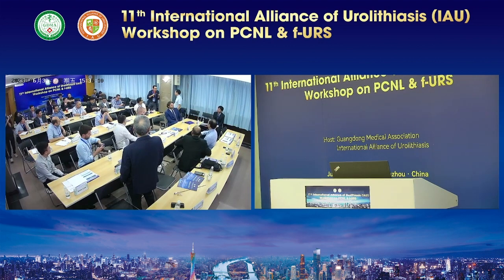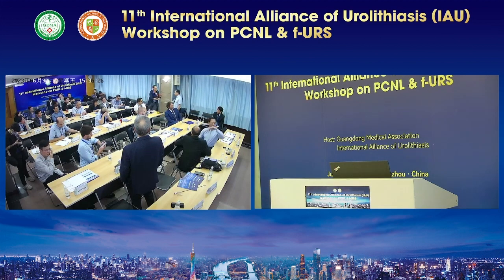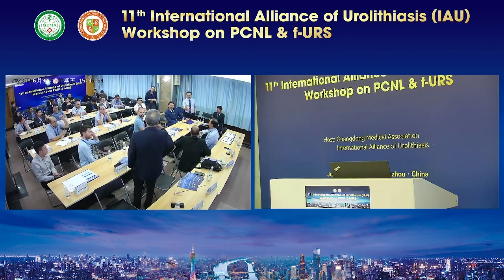We can do, for example, 2 punctures before dilatation. It's easier to do the second puncture before the dilatation for the first. Or step by step: perform one and eliminate the stone, and then perform another tract. Yes. But it's a little bit difficult to do the second. If you only use ultrasound guidance, it's difficult to perform another puncture. But under X-ray, you can do one by one. And then make dilation, the lower stone, sometimes you don't need. Sometimes blood flows.